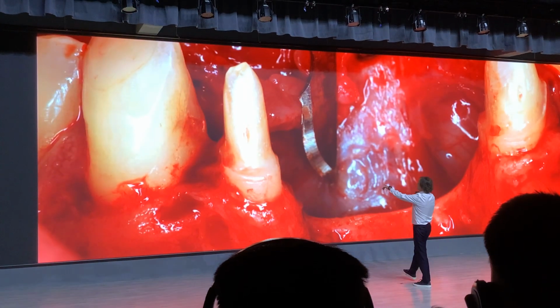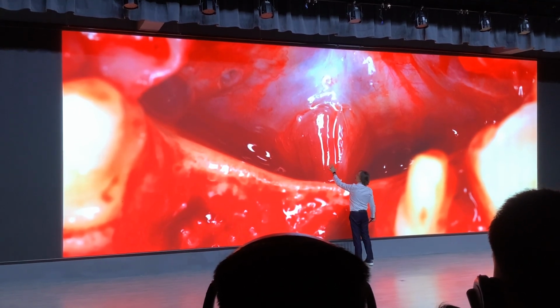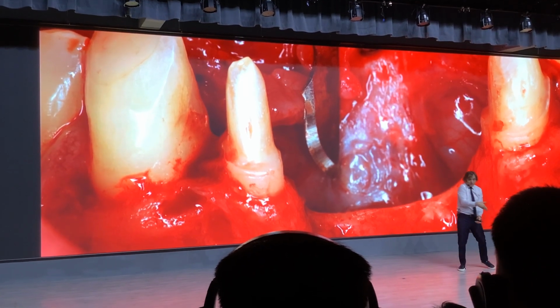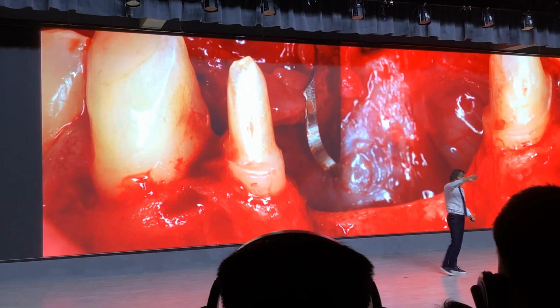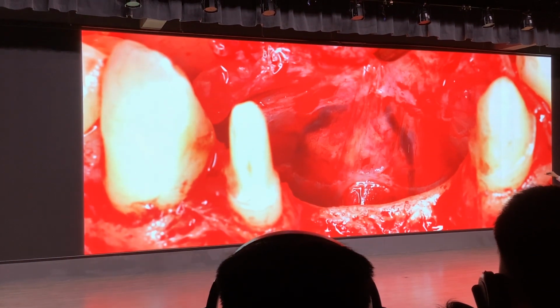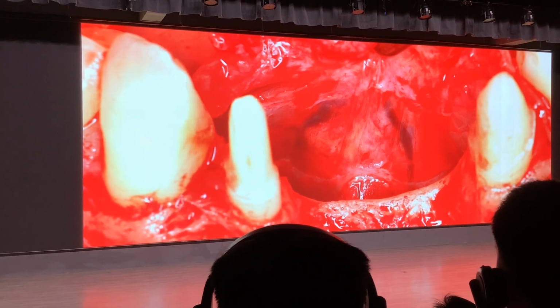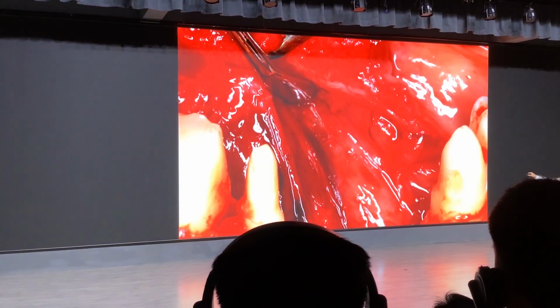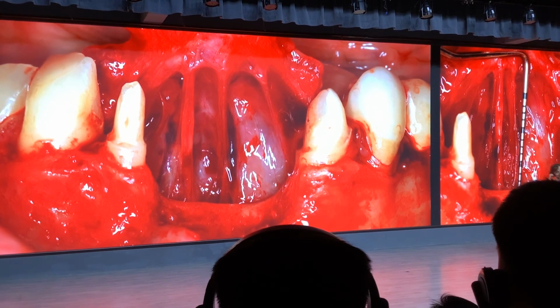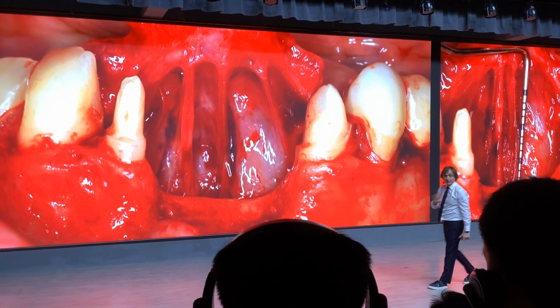We make the flap. This is the genioglossus muscle. Then parallel, scratch, and then we stretch it up. There is one artery behind this, one artery behind this. All we need to do is stretch, stretch, stretch. And then we're going to have these. This technique, the lingual flap, is best to practice on a cadaver first.